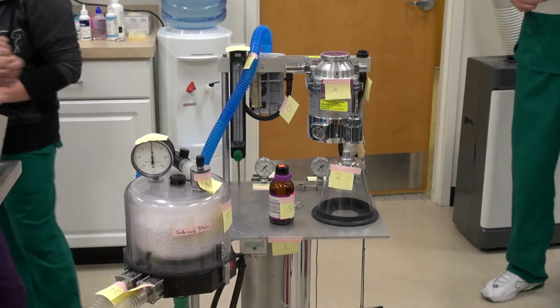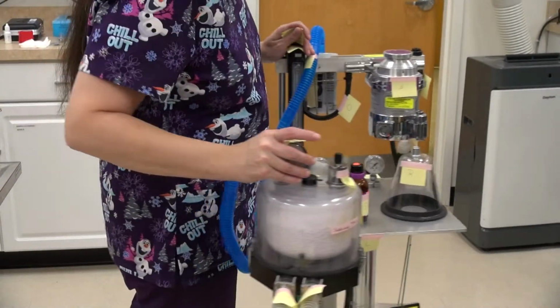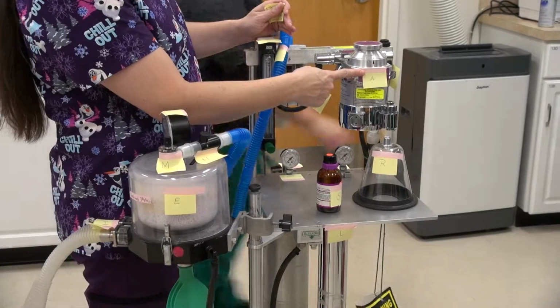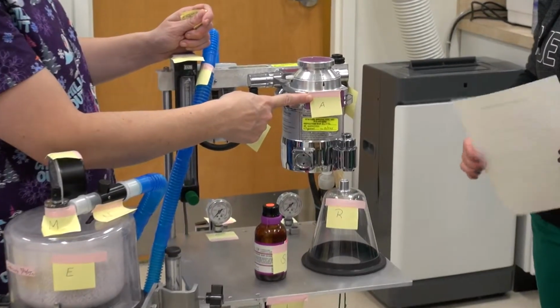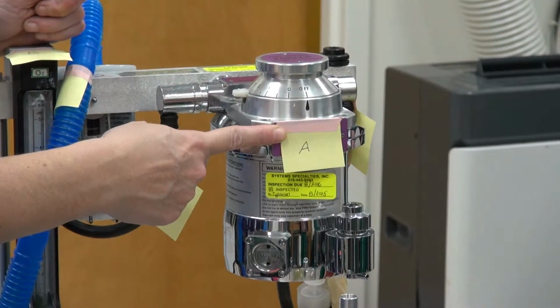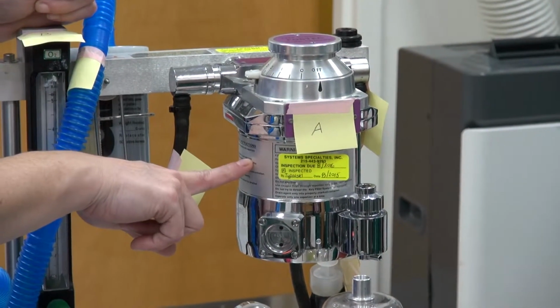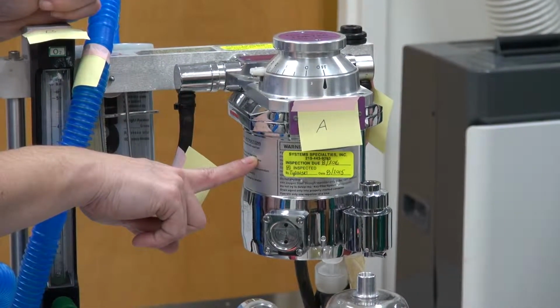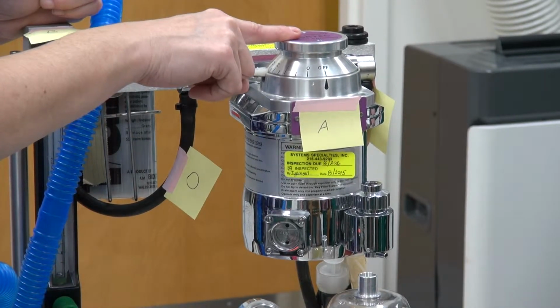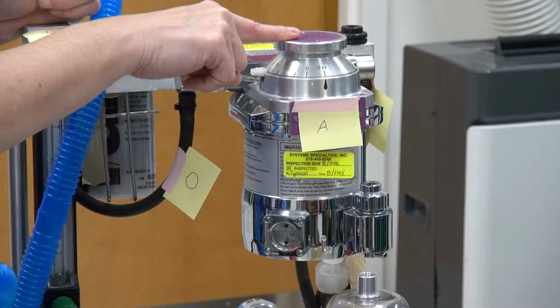Right, gang. So, we're looking at our anesthesia machine right here, correct? What is our A? What kind of vaporizer? Precision. Right. What is in this vaporizer? How can we tell that? Purple. If we had sevoflurane in this machine, what color would it be?